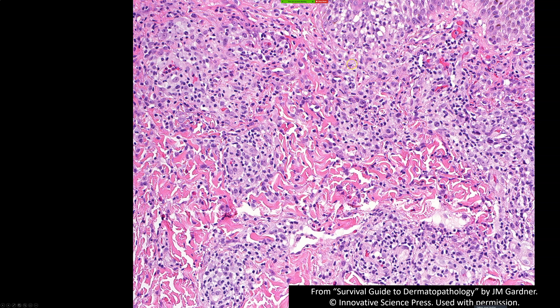As we go in closer, you can see there's a mixture of cells here — cells with abundant cytoplasm. When I see big cells with a lot of cytoplasm, the first thing that crosses my mind is histiocytes, but CD30-positive lymphoproliferative cells or reactive lymphocytes can also look like this. We have large cells with atypical big nuclei, prominent nuclei, and scattered lymphocytes around them. There can also be a mixture of small lymphocytes and sometimes even neutrophils mixed in.